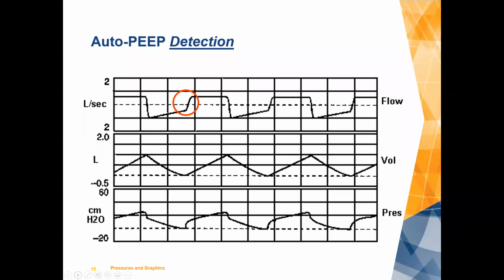So, some of the fixes, just to maybe get ahead of myself a little bit here, some of the fixes that you can really look at there is, obviously you want to look at the patient's ABGs, because you don't want to start changing a lot of parameters. You fix auto-PEEP, but you hurt them somewhere else, type of deal. But many times with most ventilators, most adult ventilators, exhalation is passive. So, you're setting obviously your tidal volume, you're setting your inspiratory flow, and what's left over is for expiration.